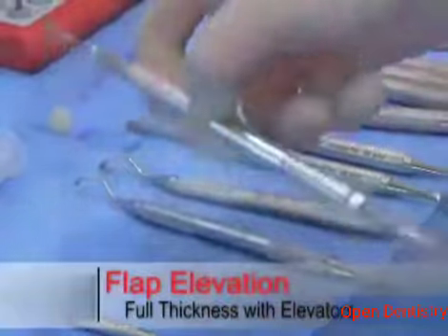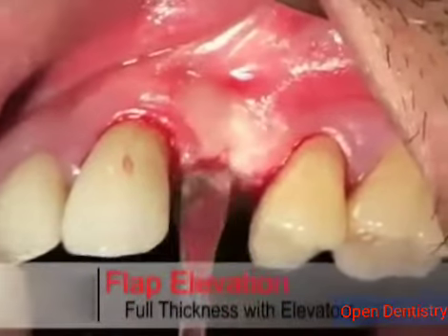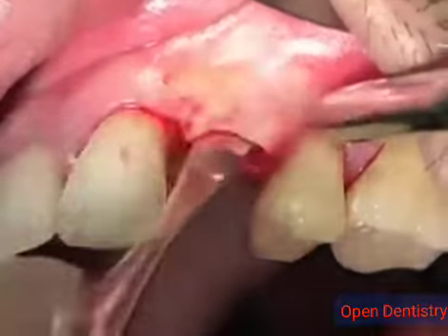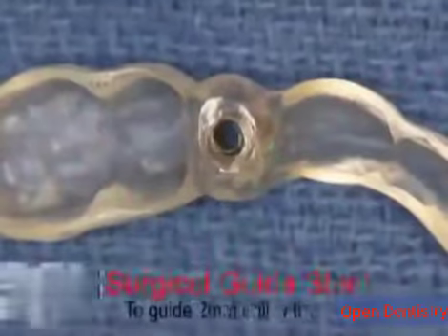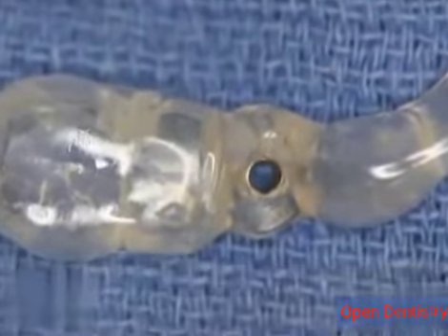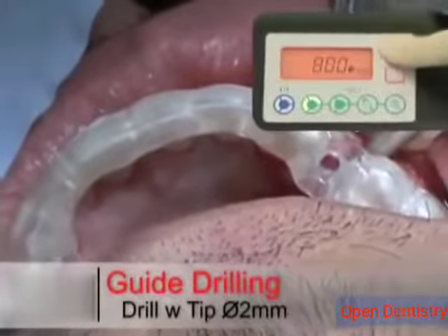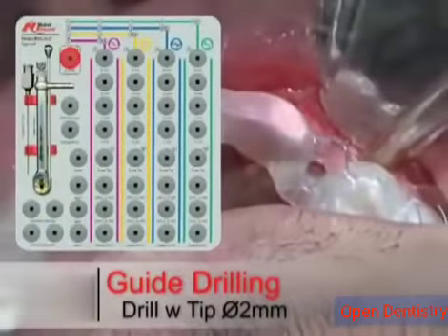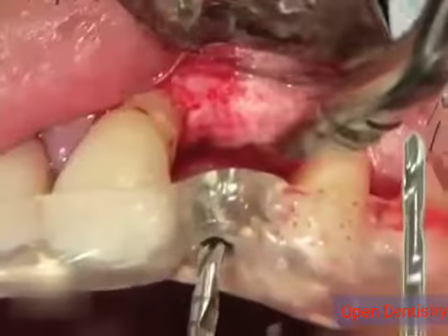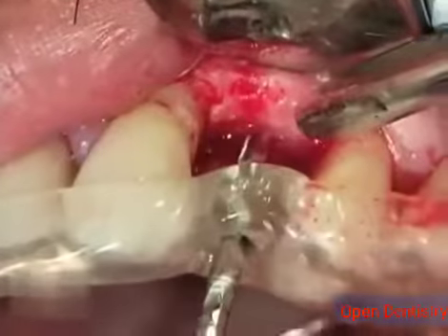Then elevators are utilized to make a full thickness flap elevation, which will show the underlying crestal bone. A surgical guide stent is used, which has an opening for a 2 millimeter drill with the optimal prosthetic position. The drill is used at 800 RPM, and it's guided through the stent into the optimal prosthetic position, which was chosen by pre-surgical diagnostics.